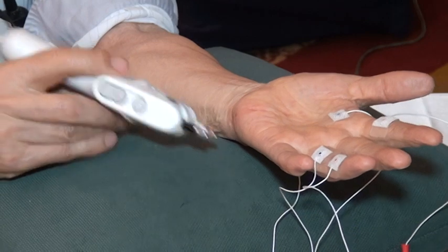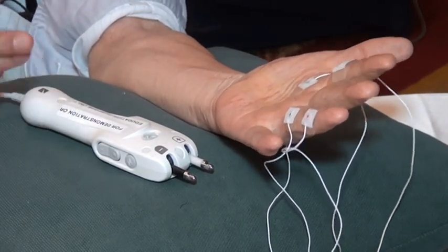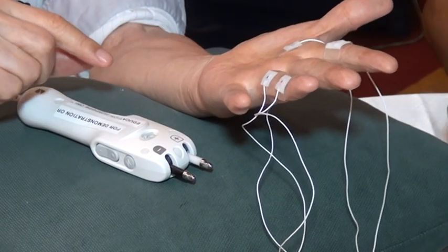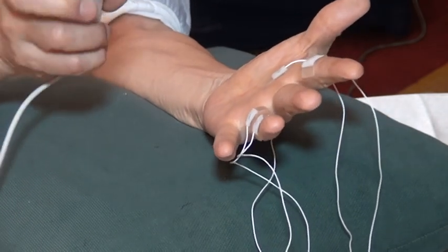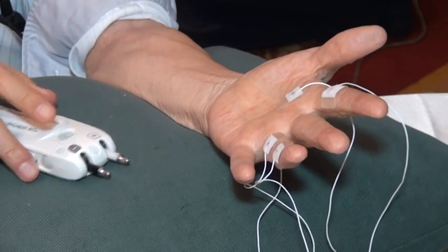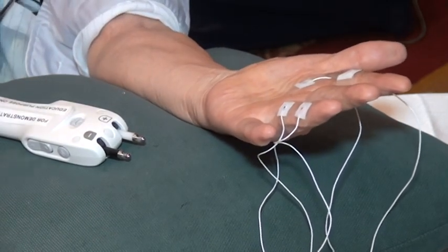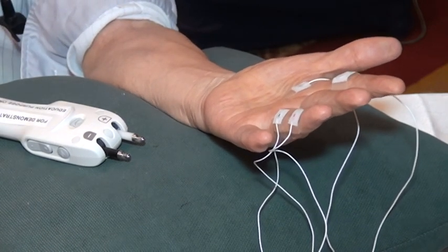And take that. Inching study is done like this. I just followed Alma there. And usually at home, our technician measures it 1 centimeter apart. Today I don't measure, and I'm moving the width of this stimulator, so it must be around 2 centimeters apart. But if you know where the nerve is, you just go along the nerve with a certain distance, either 1 centimeter or 2 centimeters, right?